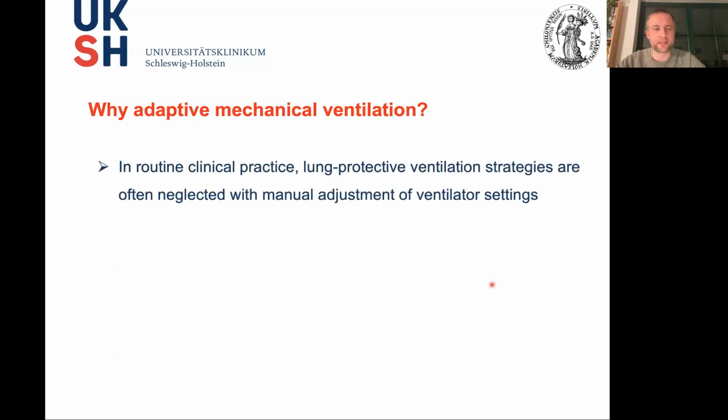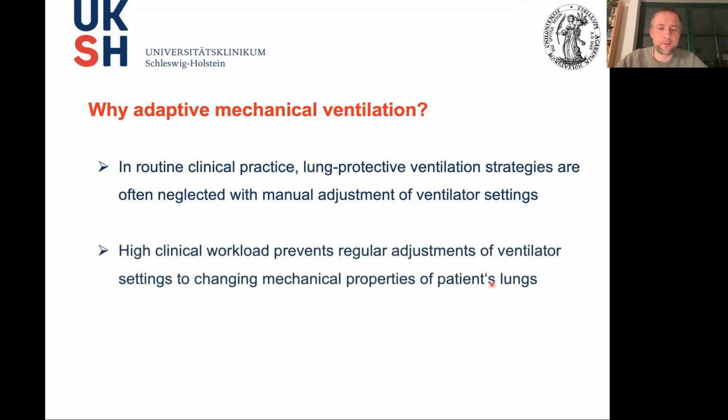So why adaptive mechanical ventilation? As we have seen in routine clinical practice, the known lung protective ventilation strategies are often neglected when we adjust the ventilator manually. Moreover, when you have a very high clinical workload, which many of us have, you cannot be present at the ventilator all the time. So when there's a change in compliance, you should normally adjust tidal volume accordingly.